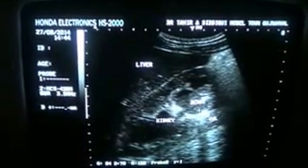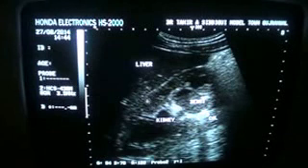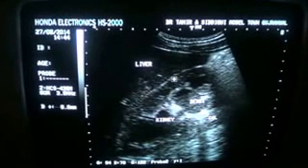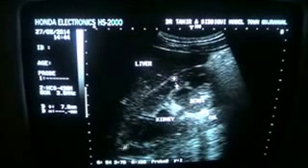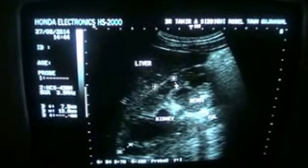This is all debris, and this is the calculus giving shadow. These are the pyramids, and this is the cortex. The echogenicity of the parenchyma is normal and the thickness is preserved at all regions. This is a case of moderate hydronephrosis.